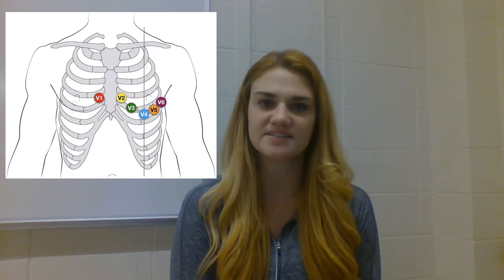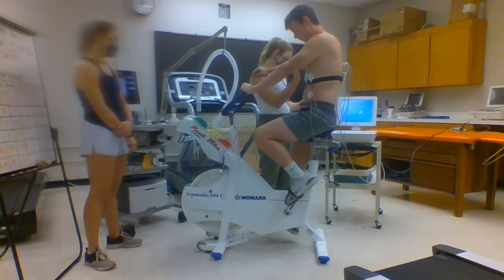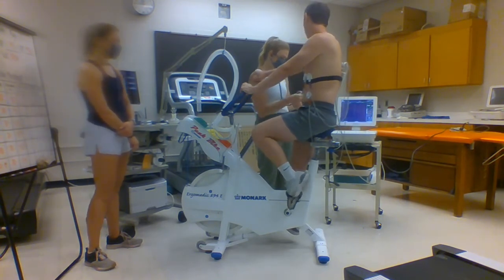V4, 5, and 6 are placed in the fifth intercostal space, with V3 directly dividing the distance between V2 and V4. Prior to the test, we will take the participants' resting blood pressure and resting ECG to ensure they are healthy and ready to begin the warm-up.